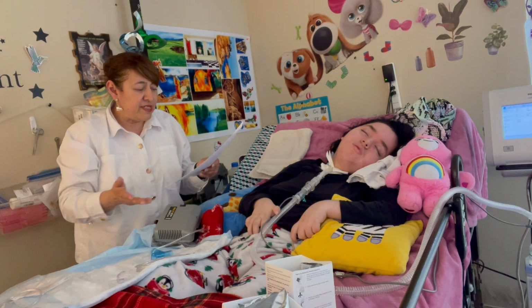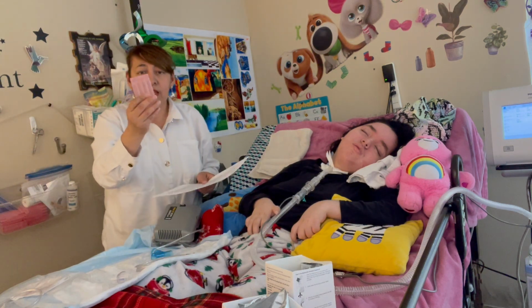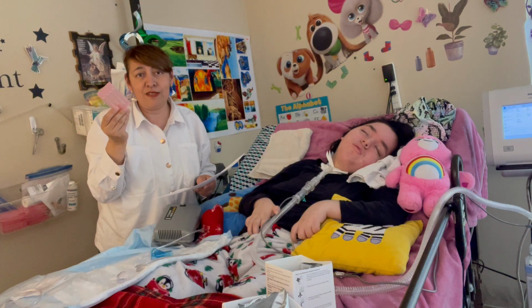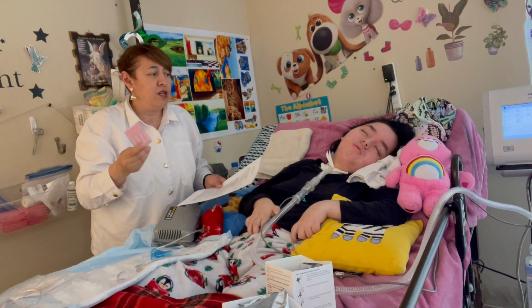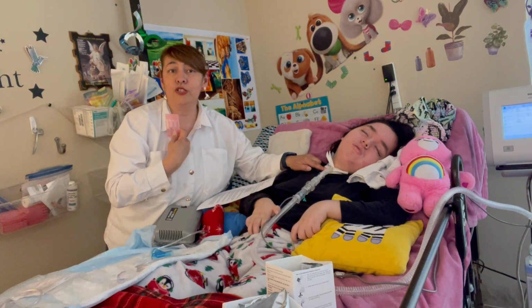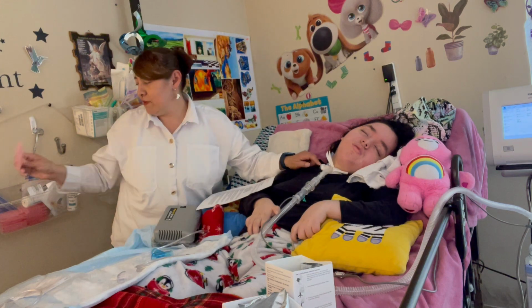Then add saline water if needed. This is saline water. It comes in a pink package. I don't use this. My breathing therapist doesn't use it. He uses it specifically to go to her trach, but not in the nebulizer machine, so that's different.